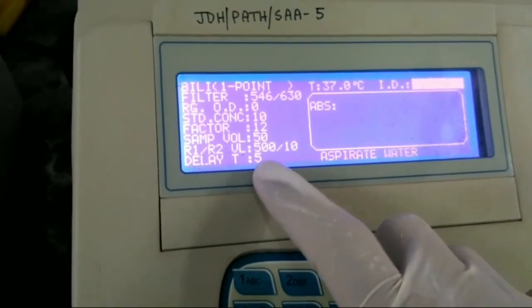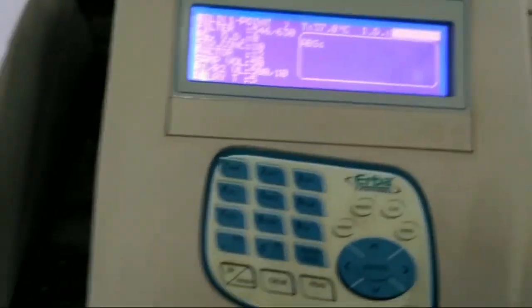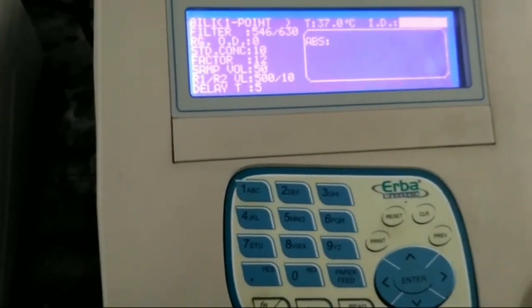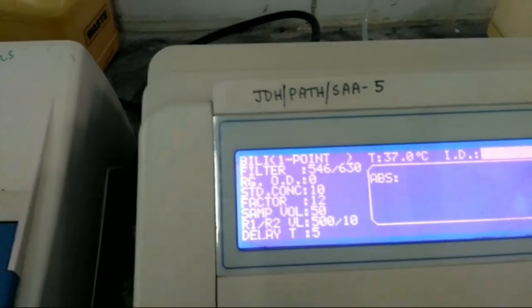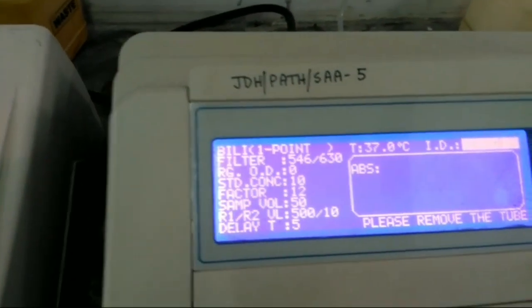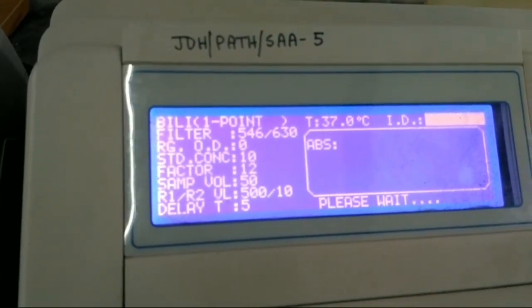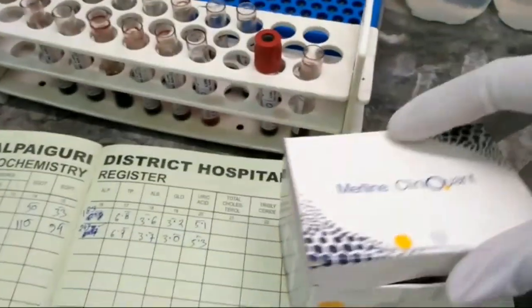Now we have to aspirate water to run the program. We have to prepare water to run the program.